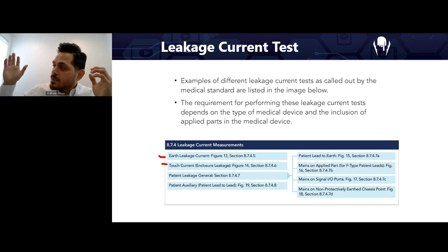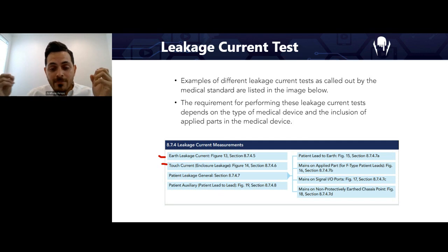So somehow my other hand comes into contact with line voltage of a second transformer, a second power source, right? Ideally, I'm floating in a medical bed, but the fact that I'm connected to another medical device and now coming in contact with the line of a second transformer, what type of leakage will I feel? Okay, and that's mains on applied part.